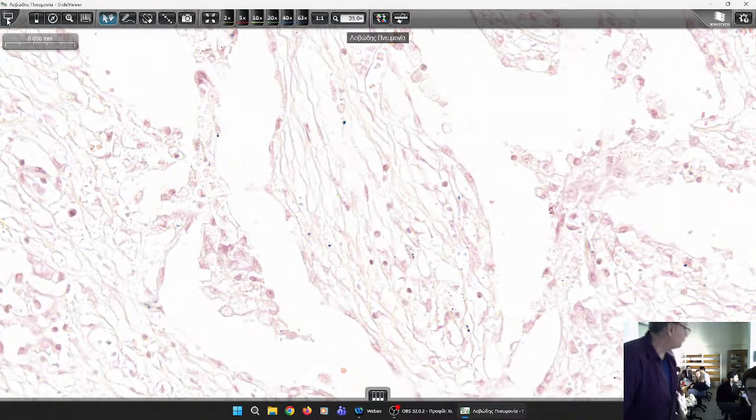Yes, please. Before we move on, can I ask something? Yep. Do bacteria always cause liquefactive necrosis? Liquefactive necrosis. Yes, from a clinical point of view. So there is no way they could cause coagulative necrosis? Coagulative necrosis is always related to ischemia in all organs apart from the brain, because in the brain it is liquefactive, even though it is ischemic. The only necrosis that is liquefactive, despite being ischemic, is in the brain. And this causes cavitation. It causes a cavity, not fibrosis, as in other parts.